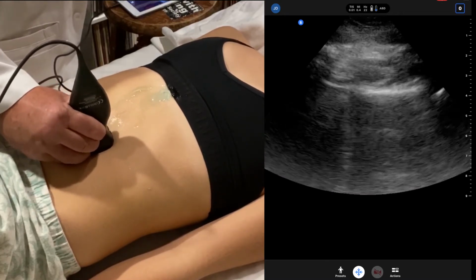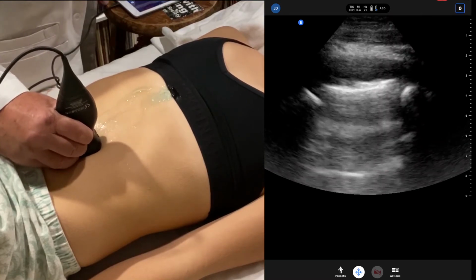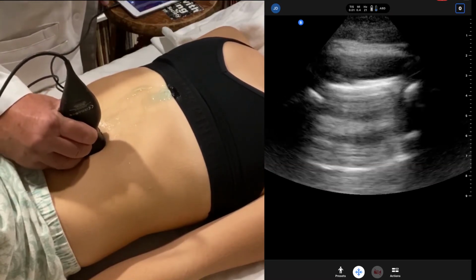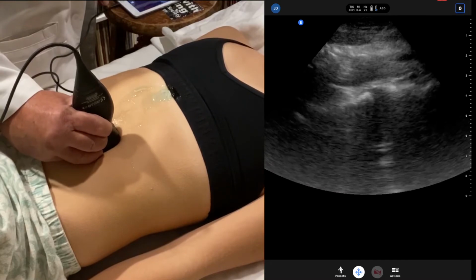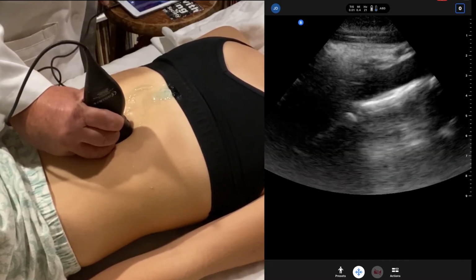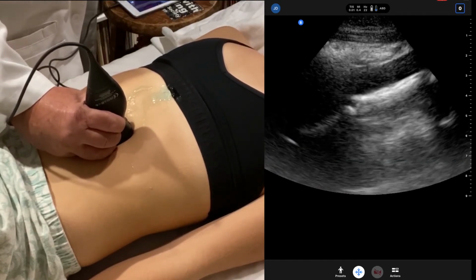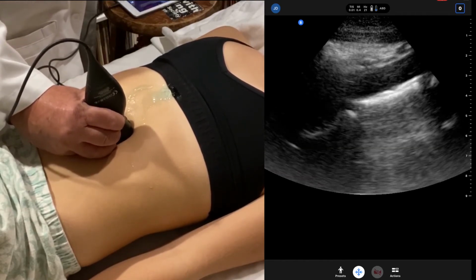We see the shadowing from the bowel. We see acoustic shadow there. The aorta is nice and pulsatile. You want to make sure you're differentiating that from the IVC as we move up. You can see that it's much more hyperechoic. There's the spine shadow from the bone.